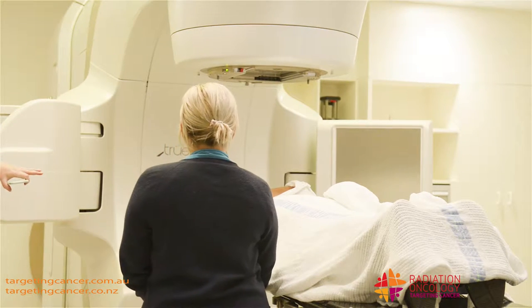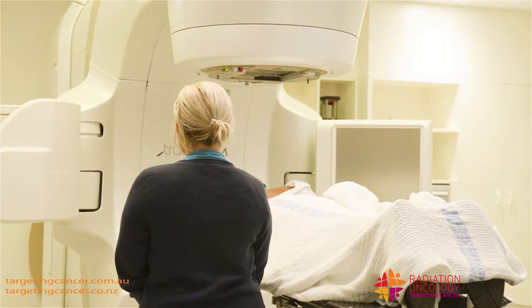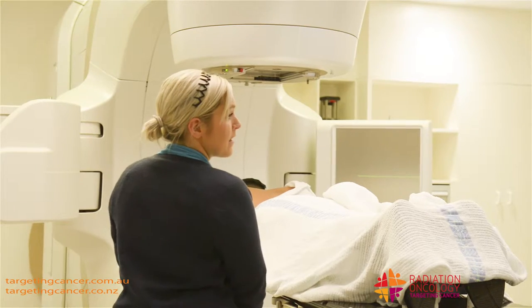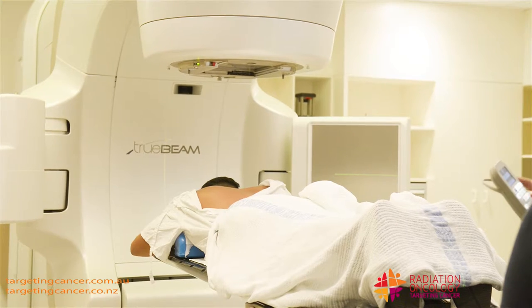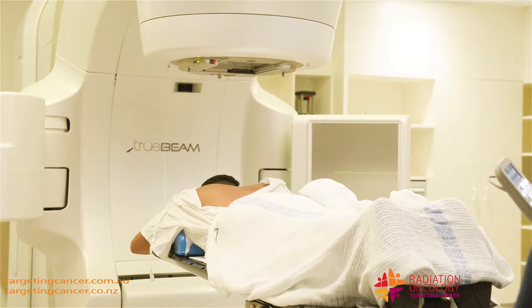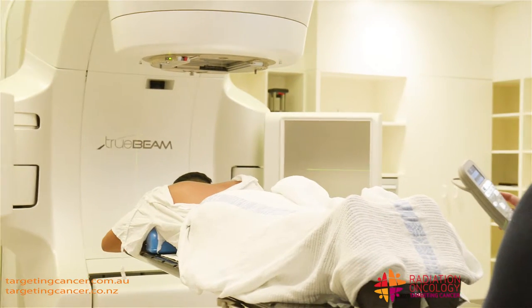While someone's lying on the treatment machine, we can extend these arms out and take an extra picture to make sure that the patient is in exactly the same position that they were when we did the planning, so that we know that we're treating them in the right area.